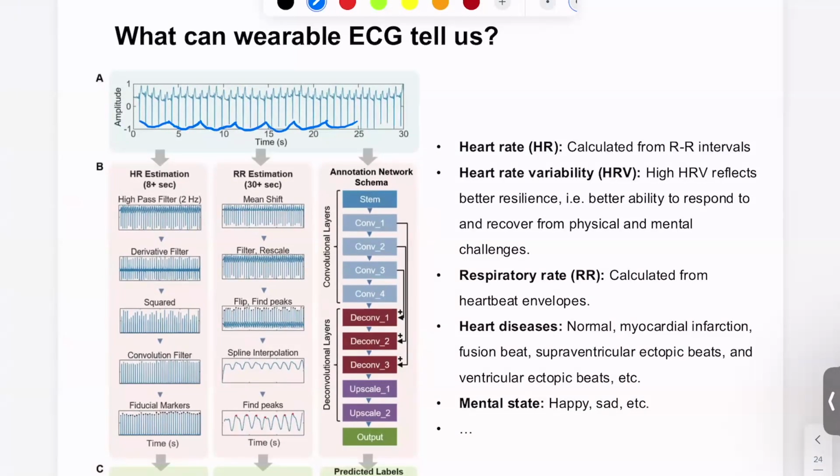Okay. Yeah. That's exactly the reason. So your chest movement changes the distance from the heart to the electrode. So that changes impedance. So that's why respiration is modulating the amplitude of ECG. Okay, that's great.